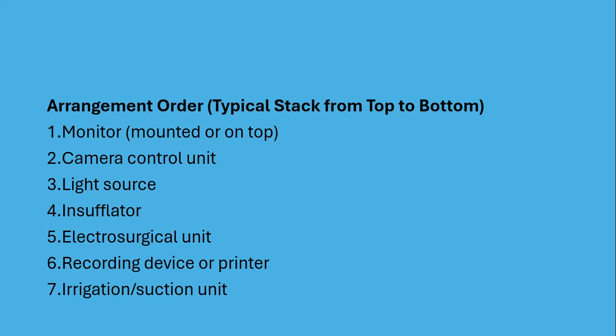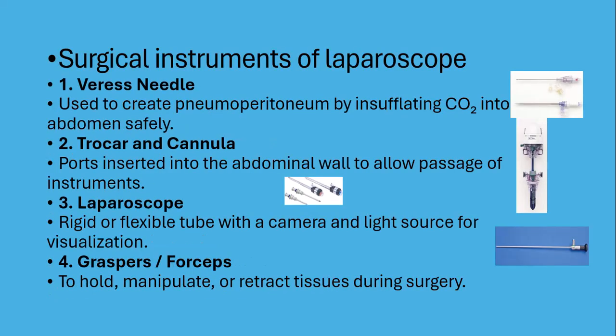Arrangement order, typical stack from top to bottom. Monitor, mounted or on top. Camera control unit. Light source. Insufflator. Electrosurgical unit. Recording device or printer. Irrigation/suction unit.